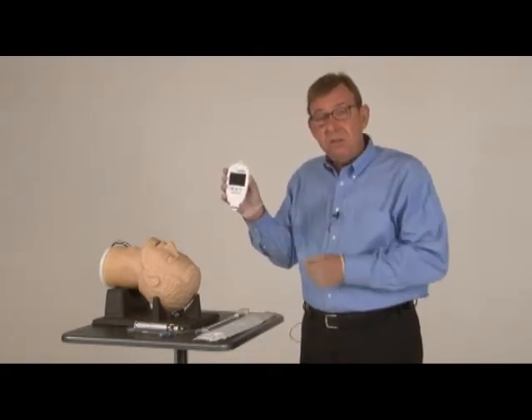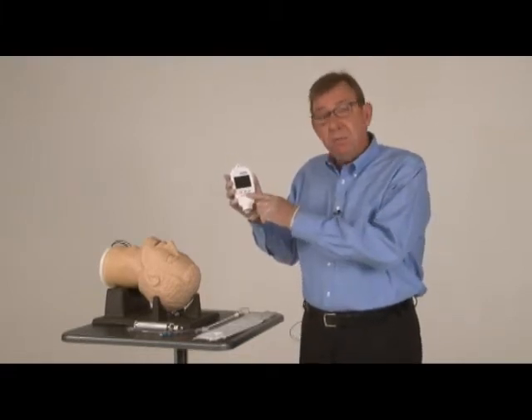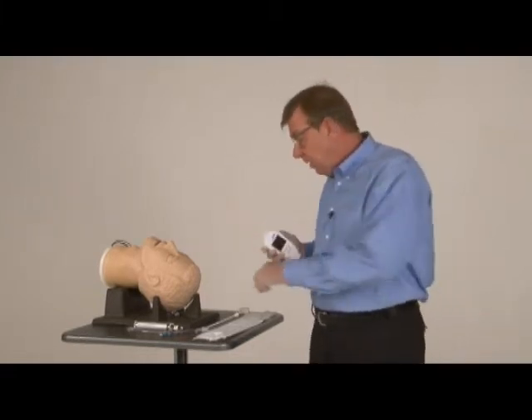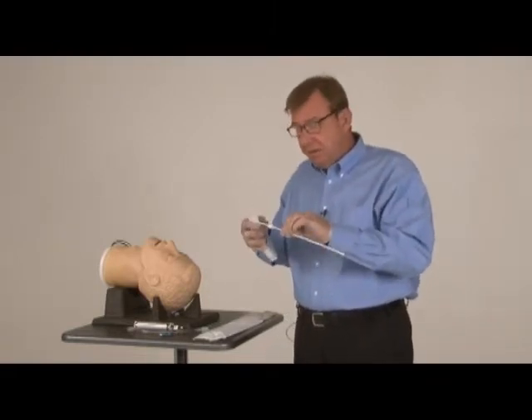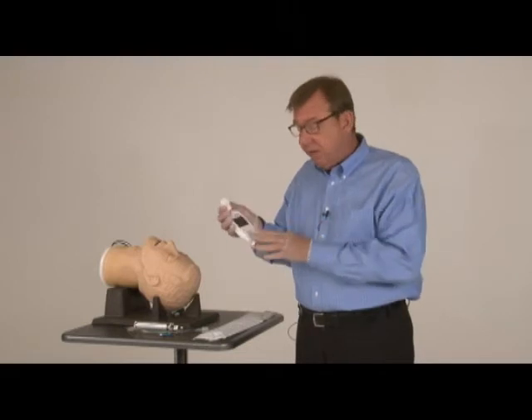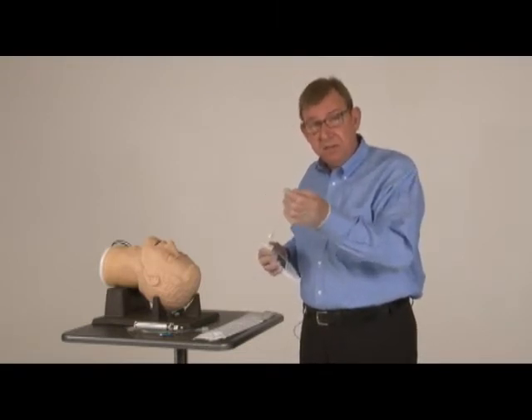This incorporates a 320x240 resolution color display and three different buttons that I'll explain in a second. The other part is the disposable — this is the video stylet. It has a fiber optic channel that carries light from the handpiece to the tip and a CMOS camera chip in the end of the stylet.